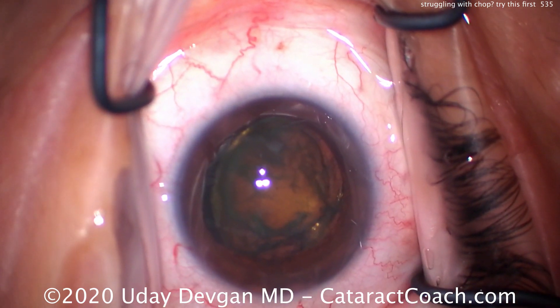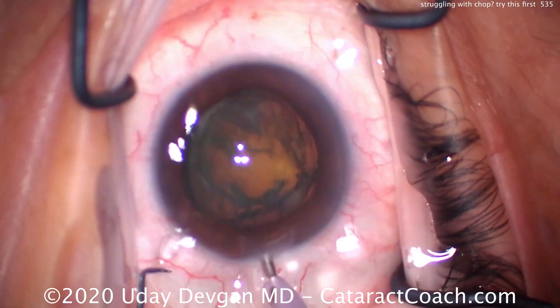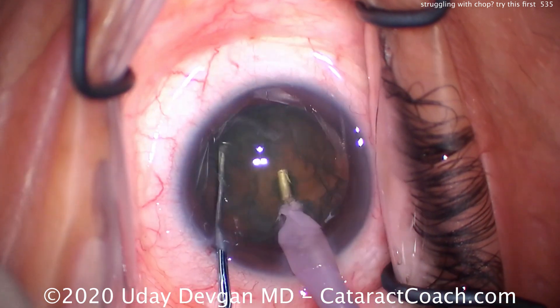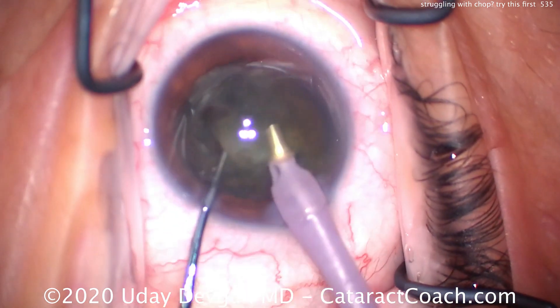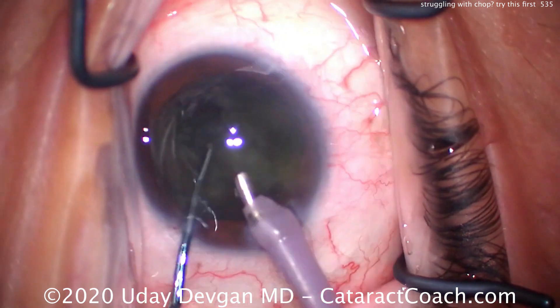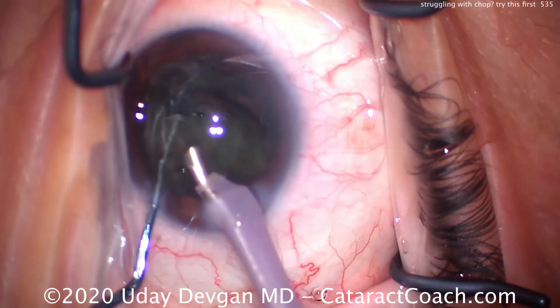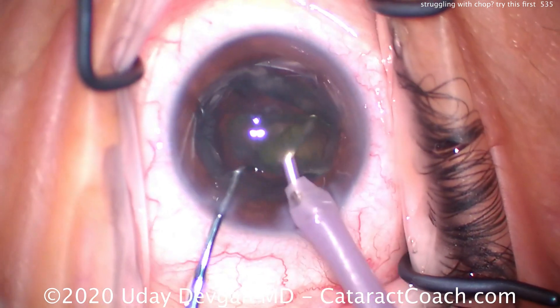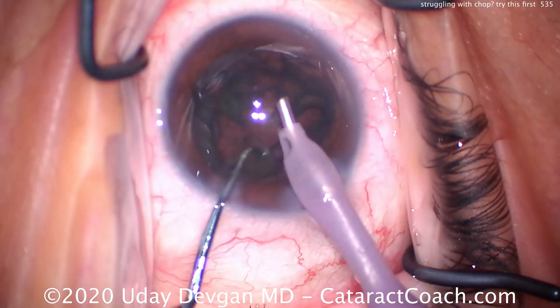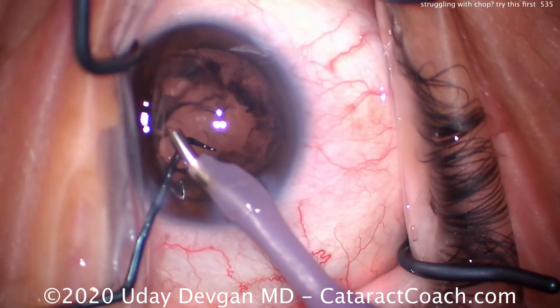Put some more viscoelastic to protect the corneal endothelium. The FACO probe is going to go in — same chop settings: high vacuum, high flow. The chopper now goes behind the nucleus, so you don't have to worry about working in the capsular bag. Now we just bring the instruments together and apart, and just like that you've got two halves. Each half can then just be emulsified. After that single chop, there's no more chopping — all you're doing is using the instruments to keep the material in front of the FACO probe and emulsifying it nice and easy. There's most of the endonucleus out; there's an epinuclear shell which will be vacuumed as well.